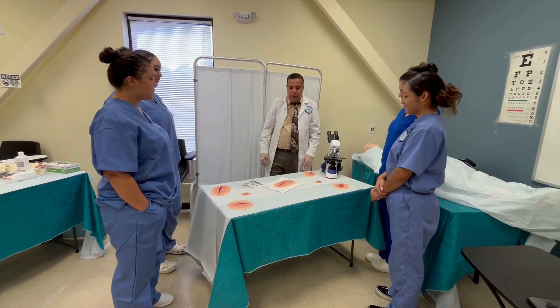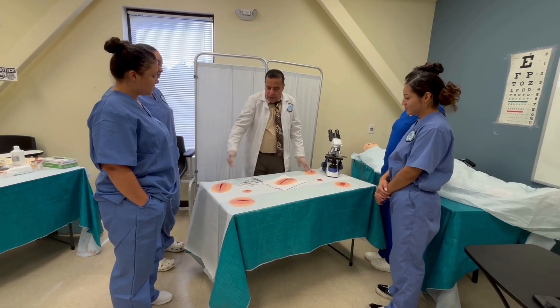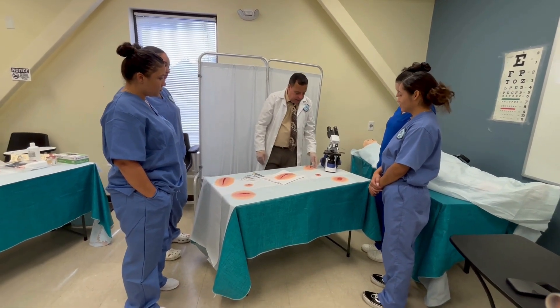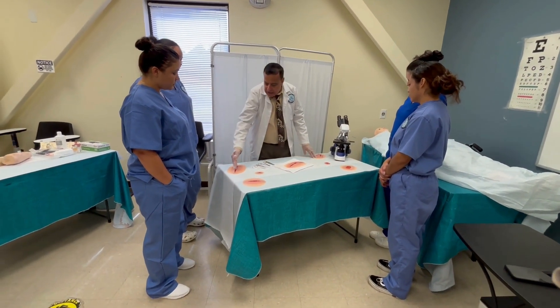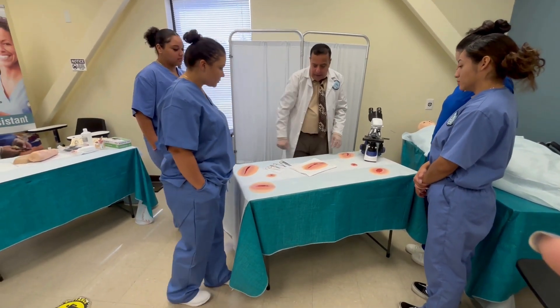Today we're going to cover how to remove stitches — suture removal. As a reminder, there are different types of wounds: this is the incision wound, and this is the puncture wound.